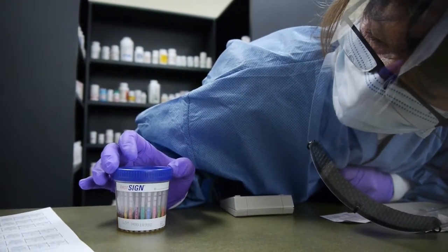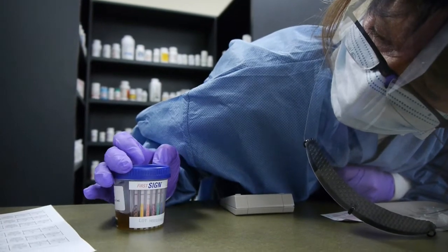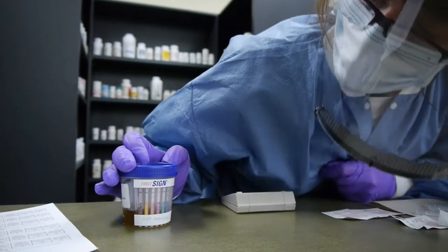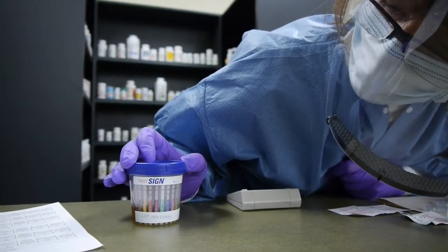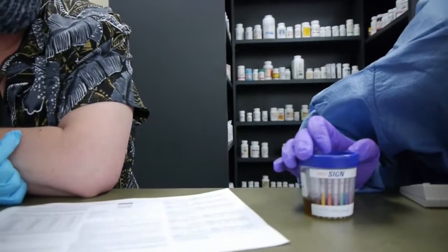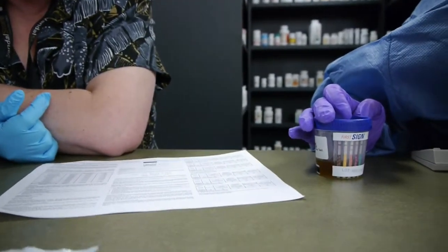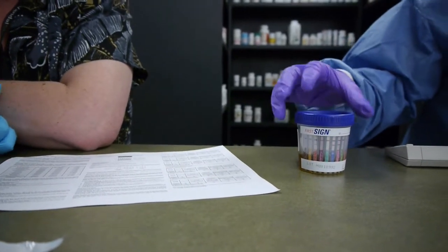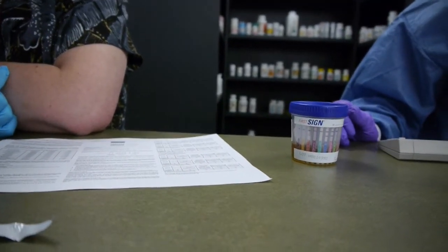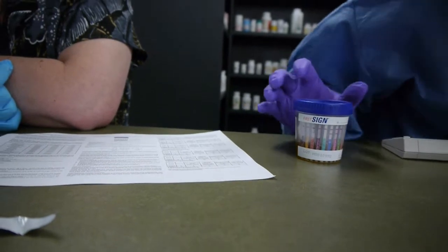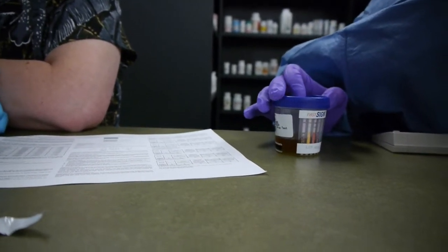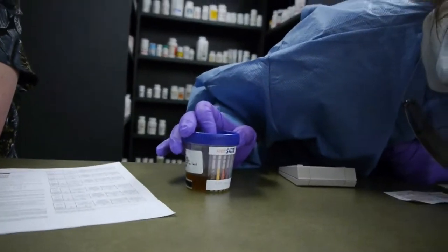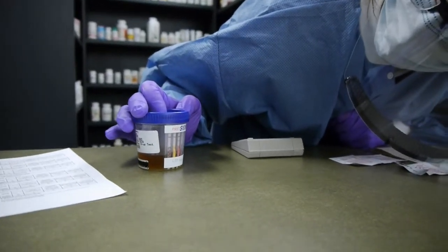Two lines is negative and one is positive. A control line needs to be there. If the test line is there, that's negative. If you have a control line but no test line, that means they're positive for that drug. Oxy is possibly positive.